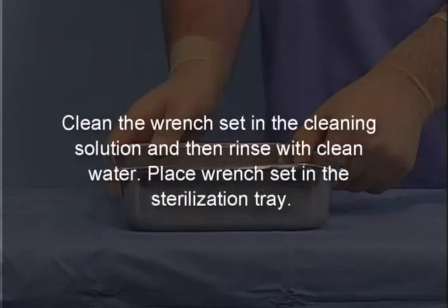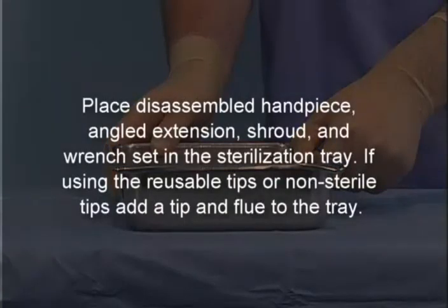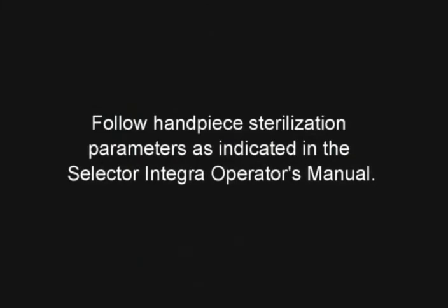Clean the wrench set in the cleaning solution and then rinse with clean water. Place the wrench set in the sterilization tray. Place the disassembled handpiece, angled extension, shroud, and wrench set in the sterilization tray. If using the reusable tips or non-sterile tips, add a tip and flue to the tray. Follow handpiece sterilization parameters as indicated in the Selector Integra Operator's Manual.